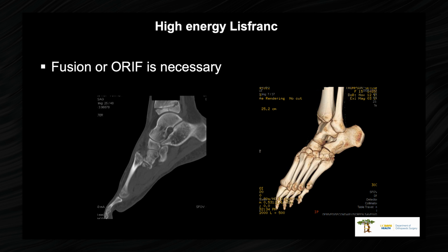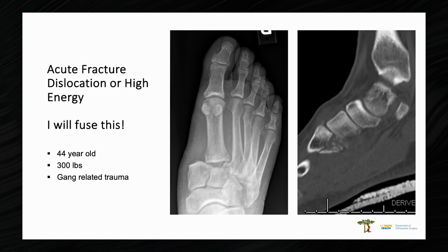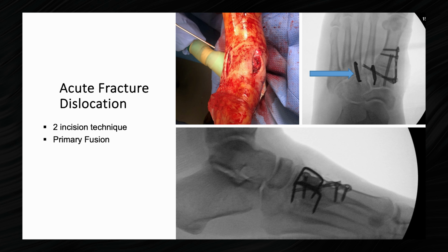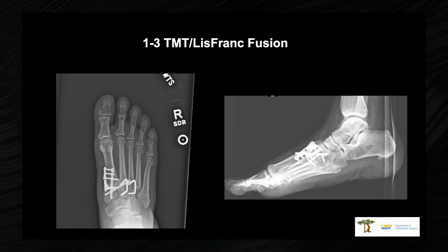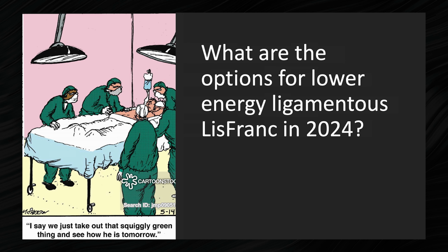Now, of course, this high energy LisFranc, how do we fix these? We're going to fuse this. I'm going to get somebody like this. This is not a LisFranc InternalBrace case. Fuse, or you get the older patient who comes in, she was about 8 weeks out. Certainly, she's better served with a fusion. But for our athletes and our younger patients, what do we do in 2024?